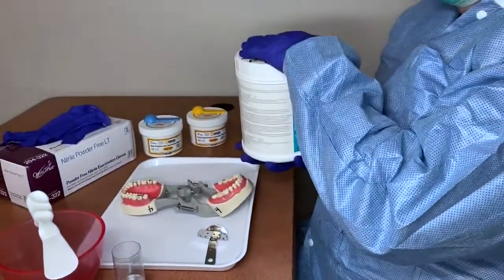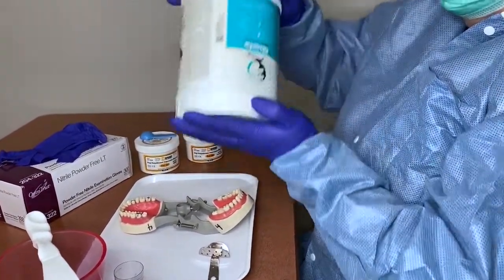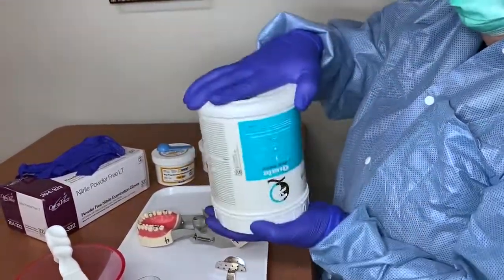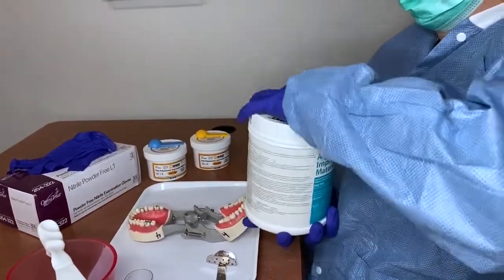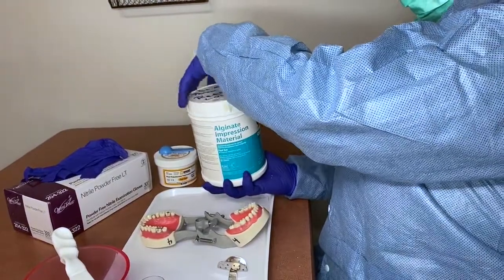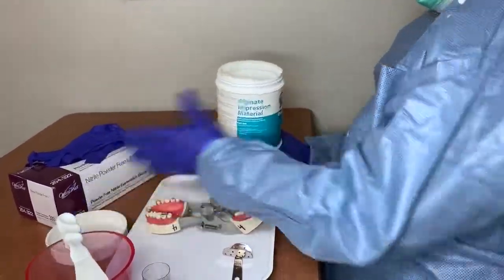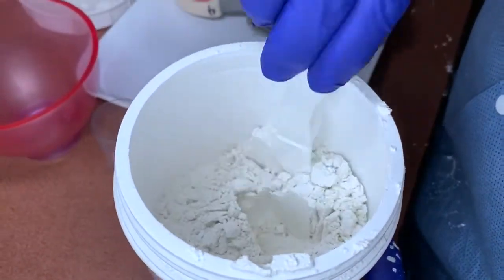When you first get your alginate out, if it's been sitting for a while it will be compacted, so you want to fluff the alginate to loosen it up. You can either shake it or put a spatula in and mix it around. Now you can see it's all fluffed and not compacted down.